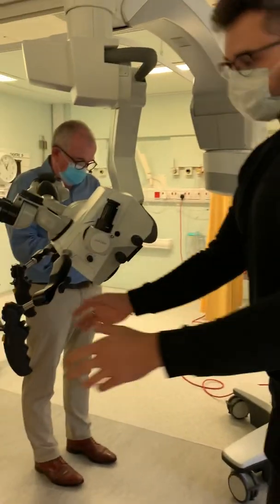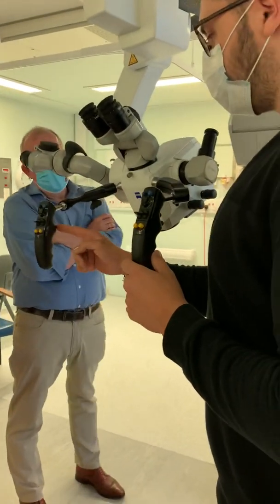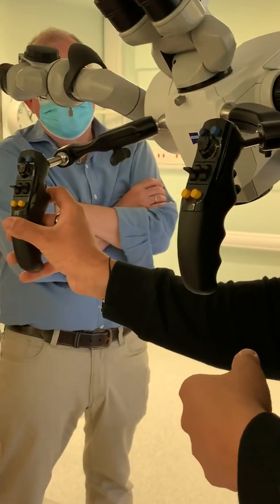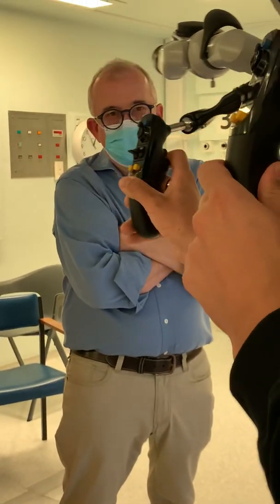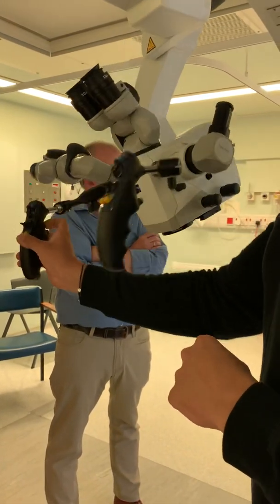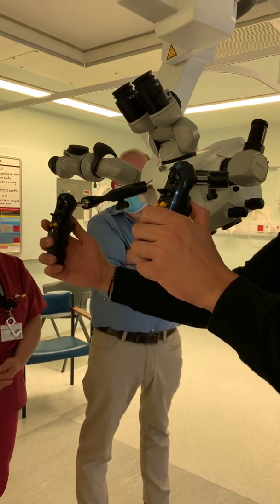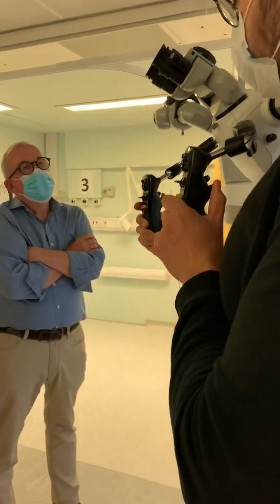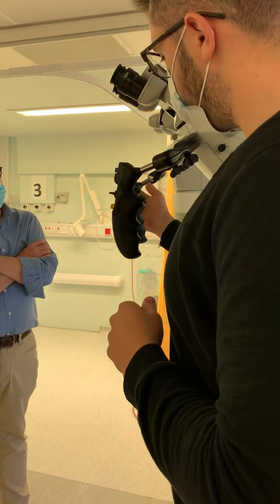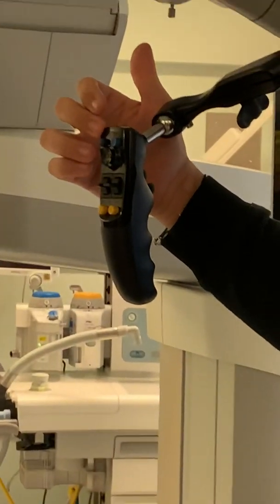Now for the controls on the microscope itself. On the hand grips you've got two buttons on the back. Nine times out of ten you'll use the bottom button — they do the same on either side. Like your previous microscope, these are the stand brakes: it can rotate the arm and the microscope head. The top button moves just the microscope head, not the stand. You can press one or both sides — it's your preference. On the front of the hand grips you have programmable buttons on either side: photo, video recording, speed focus, or whatever you choose.